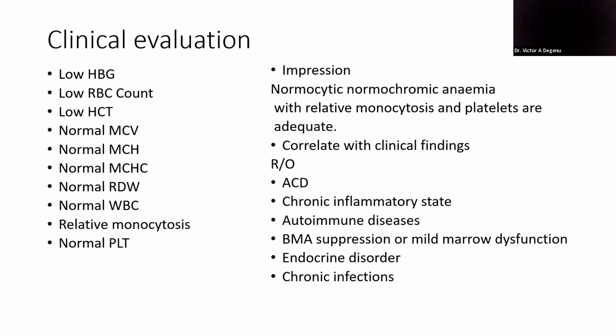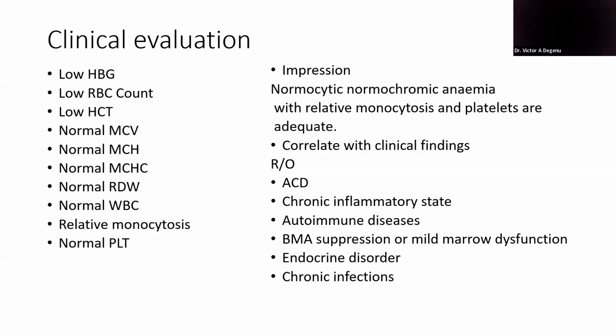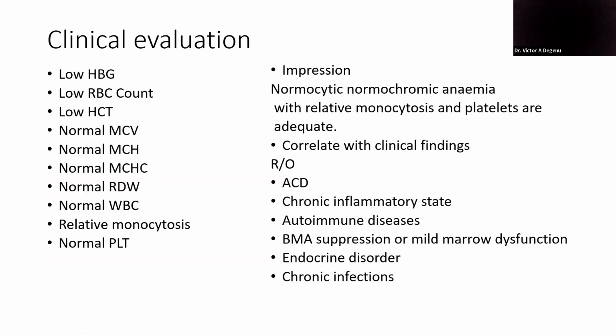Yes, we are following. That is why I did not bring the pictures of the histogram, but it's there. If you look at the full blood count carefully, you may see signs of the histogram below. But because we will have another opportunity to interpret histograms in relation to the full blood count result, I did not bring it. We'll have another opportunity to look at all the things that the histogram picture depicts to us.